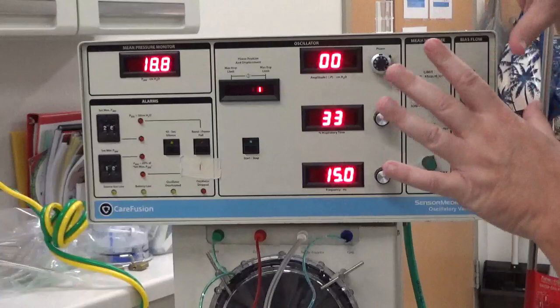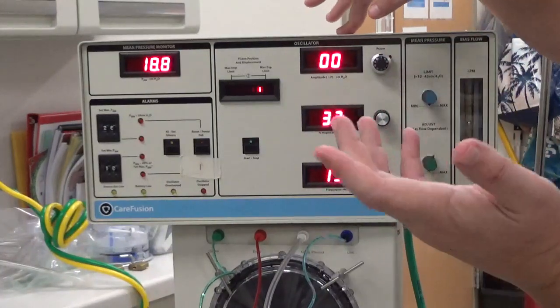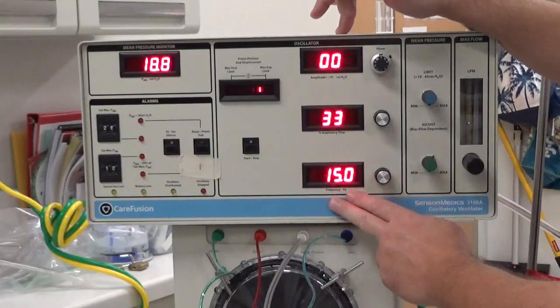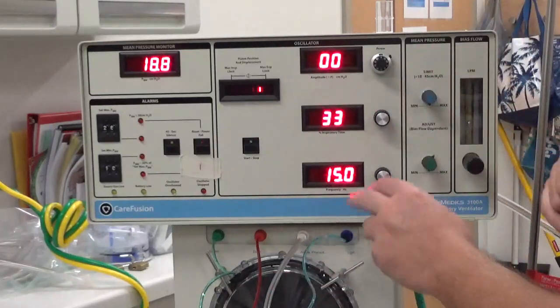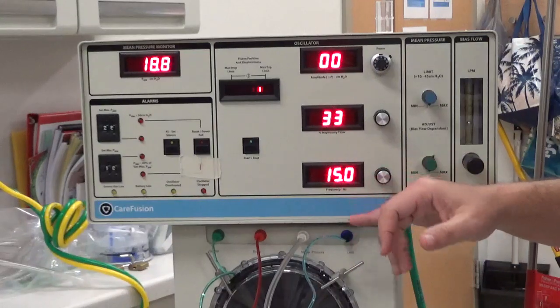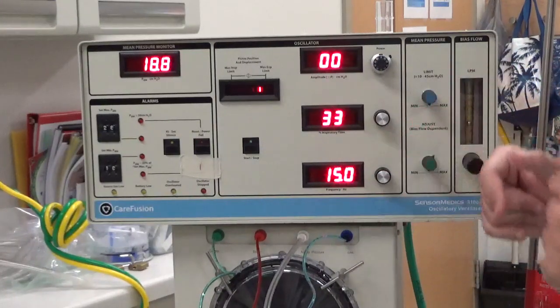Ventilation, pretty much the same, except instead of a PIP, we'll have an amplitude, which is pretty much synonymous with PIP, and then we'll have a frequency. Frequency is pretty much the same, except 1 hertz is actually equal to 60 breaths per minute. So if we were on 10 hertz, the ventilator would be giving 600 breaths per minute.